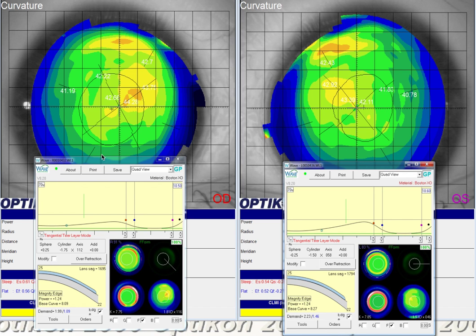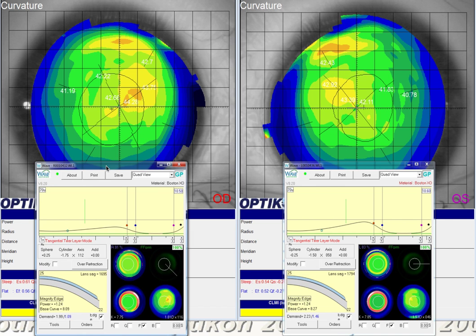Hopefully your patient understands. And anytime we have higher cyl relative to sphere, it makes the case a little bit more challenging. With the rule cylinder is easier to mold, and I would say oblique is going to be the most difficult. Add on top of that, we get a little bit of conflict between what the patient's getting in the refraction versus what's on the cornea, suggesting there's a fair amount of internal astigmatism that we would need to take into account.